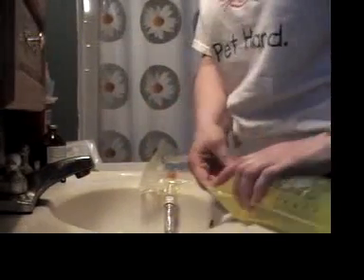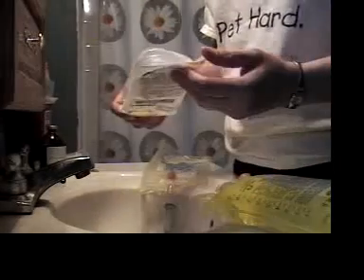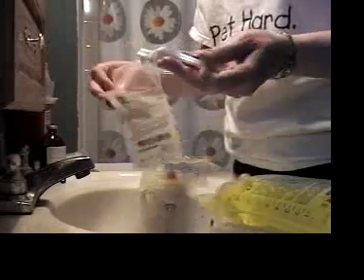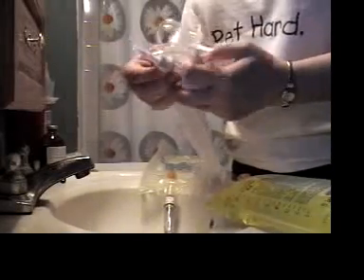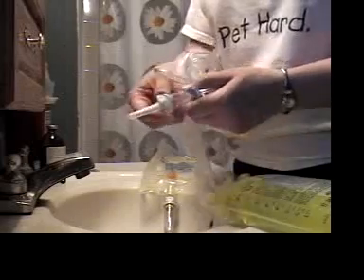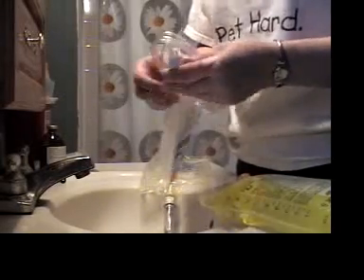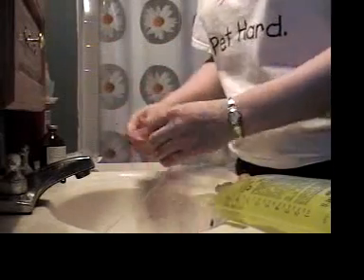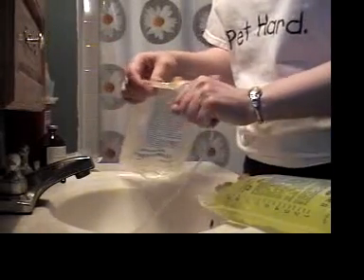Now to add the line, usually you would start with a new line. You'd remove it from the bag. There is a little cover here over the end that goes into the fluids. You would simply remove this cover and add it to your bag. Personally, I use a line twice. This line has only been used once, so I'm just going to use this line again.